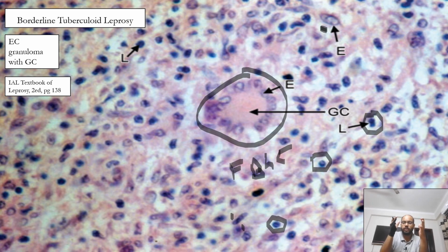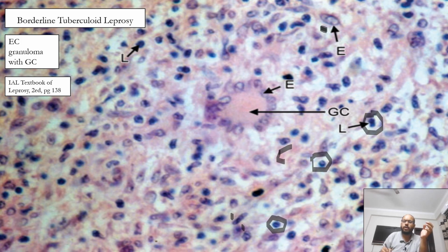So just look at this picture. Now, I'll remove the markings. And look at this picture, and you can see a lot of epithelioid cells, and you can use this picture to memorize or practice finding out lymphocytes and epithelioid cells. So many epithelioid cells are there. So this is what you see: epithelioid cell-rich granuloma with few scattered giant cells of the foreign body type. Let's move forward.